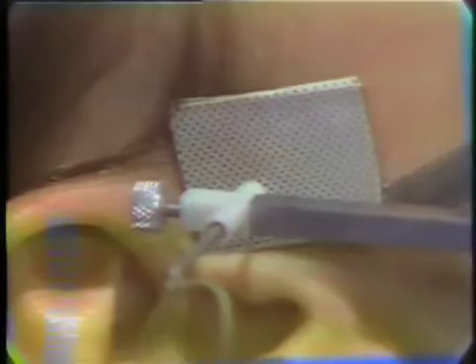So just hold it there. We'd move the stylus down and backwards to a new dot, and then we'd open and close again. Open a little bit, until we decrease the arcing until the stylus is merely rotating. Hold it there. This is the terminal hinge axis. This is the exact terminal hinge axis of the patient. As the patient opens and closes on the hinge, the point stays still.